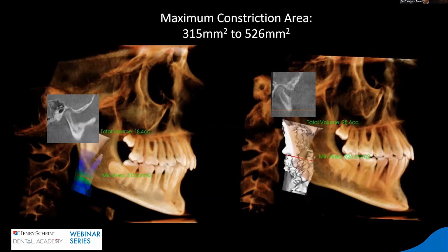If from that information I see some degeneration, some erosion or something, then in the following exam I take a higher radiation, maybe the same voxel size, but more like 8.9 or even more time in the radiation, so I can see more detail in the cortical line to see progress or regeneration of the TMJ. So that is the question, because these condyles are not beautifully corticated, but it's not because the patient presented pathology, it's because I didn't give the patient that much radiation because I didn't need it, okay?